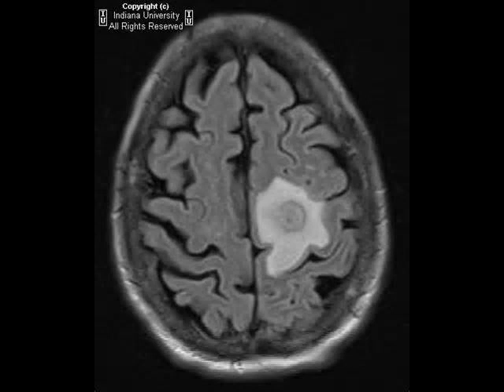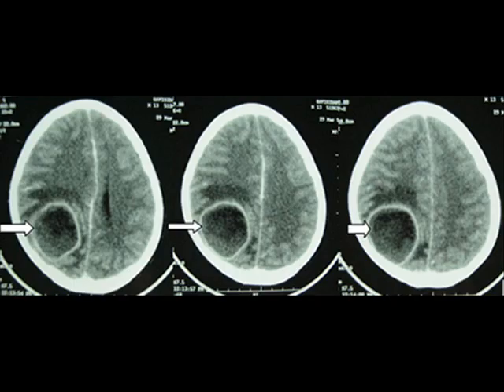The enhancing rim typically has a smooth inner margin and shows thinning of its medial aspect. In comparison to cerebritis, the center of the abscess never enhances on delayed images. The degree of enhancement is diminished in patients who are immunocompromised or are on corticosteroid therapy. Abscesses rarely contain gas, most often caused by surgical intervention or communication with the cranial airspace, rarely because of a gas-forming organism.